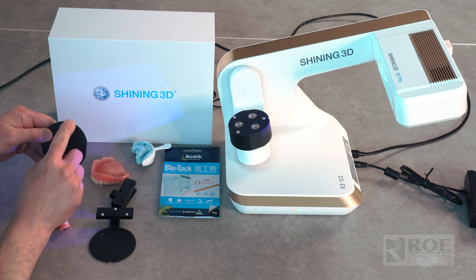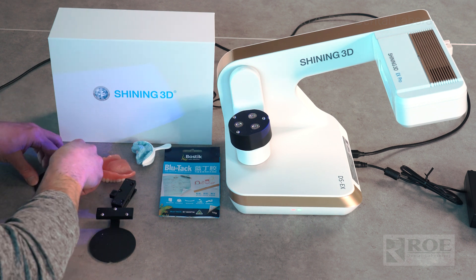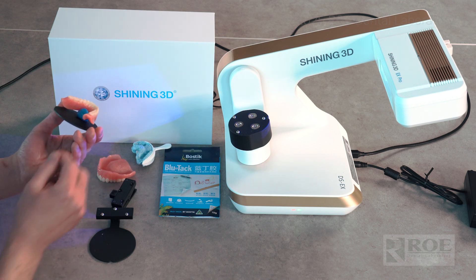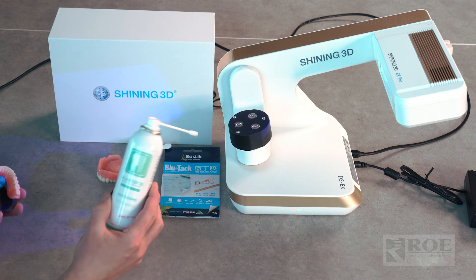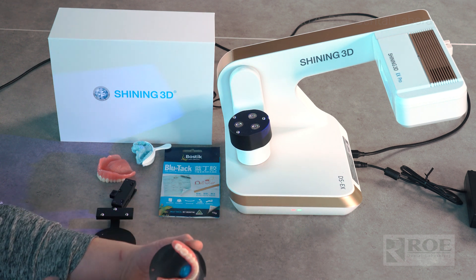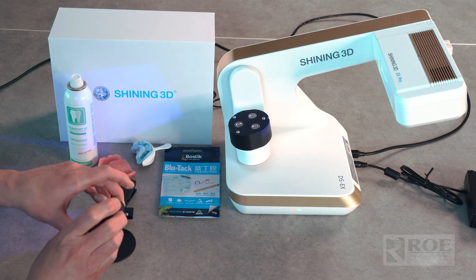Grab the base plate — you'll see the notch. Get your blue tack and make a little cube shape; that keeps the denture off the plate so we can cut it out later in the scan. Fix the denture on the plate, keeping it as parallel as possible. Then grab the scan vanishing spray — this disappears on its own and gets rid of glare so the scanner can pick up all the data. Line the notch up with the notch on the device.